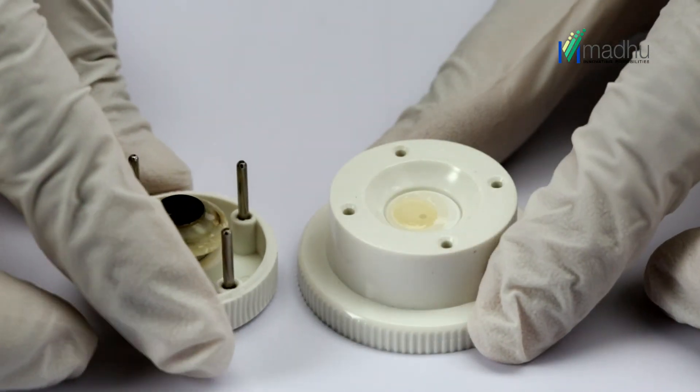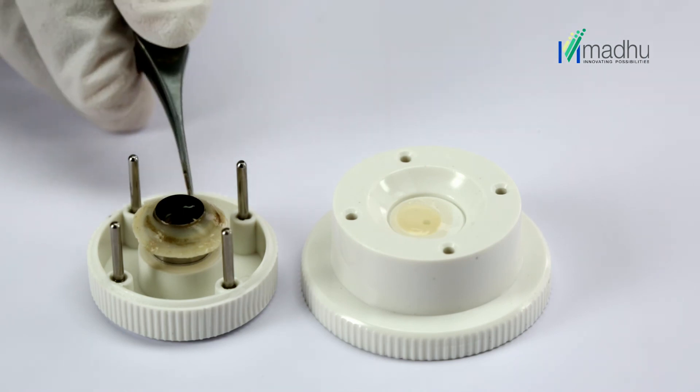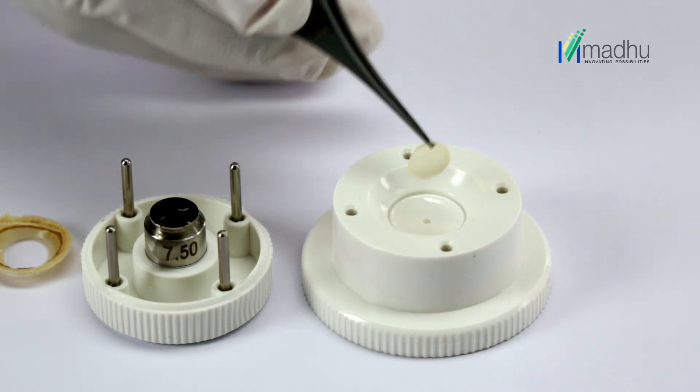With one hand, pull the trephine blade housing upward with the other to remove it. Grasp the scleral rim with a fine-toothed forceps and remove the rim. A donor corneal button of the desired diameter is now ready for use.